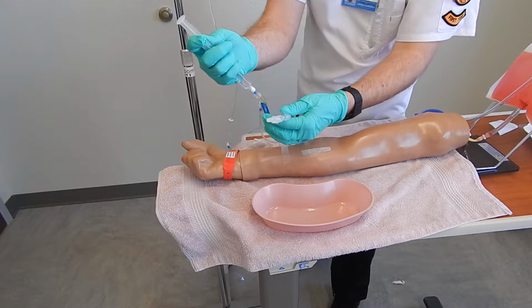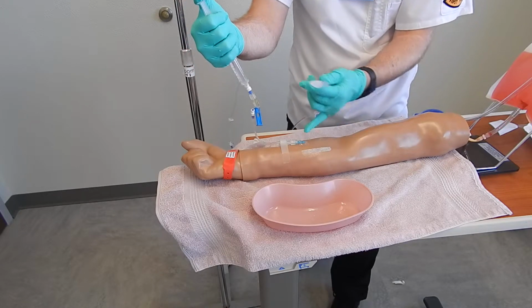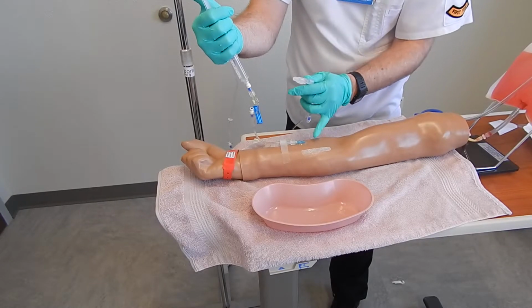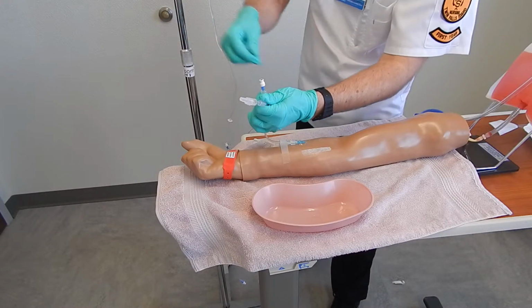That would check, and it has patency. I will go ahead and flush it, observing the site here for any phlebitis or any skin irritation or anything. It flushes well. So I can go ahead and take that off.